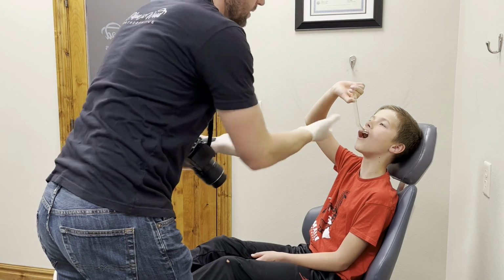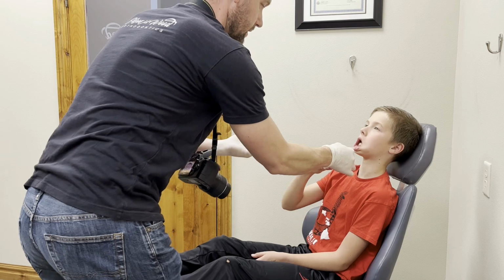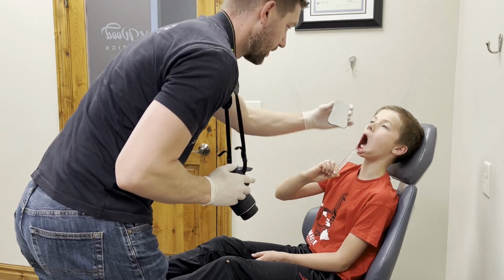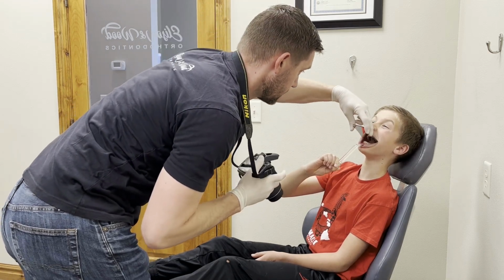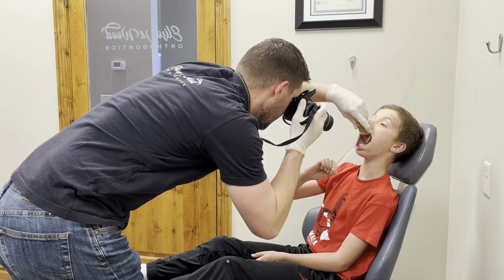Okay, same thing. We're going to switch this over to do the lower lip. Just hold it right down like that by the end. And then open your mouth really big, kind of turn toward me a little bit, and raise your tongue up to the roof of your mouth. And open as wide as you can. Wide, wide, wide, open, big, big, big.